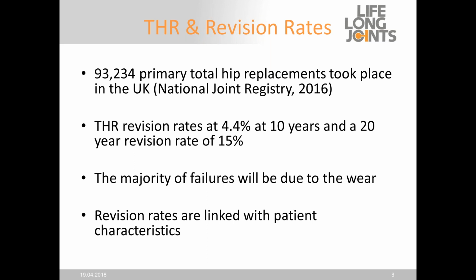And we know that the majority of these failures will be due to wear, and the wear is often a consequence of the use of the implant. But we don't truly understand, or we don't really test, how our patients are actually using the implant preclinically. We know that the revision rates are linked to different patient characteristics, so all patients aren't just a single entity, and they walk, move, and do different activities of daily living. So this is what we want to explore within this study.